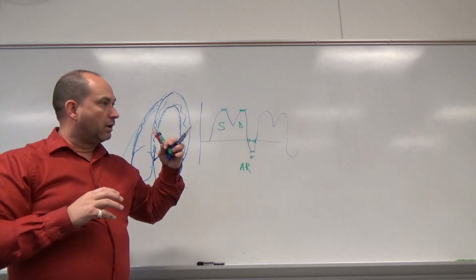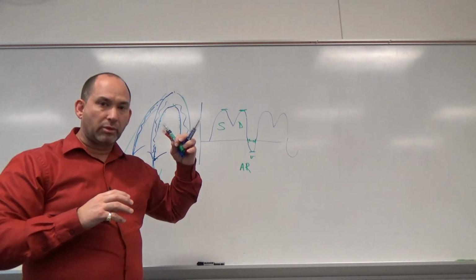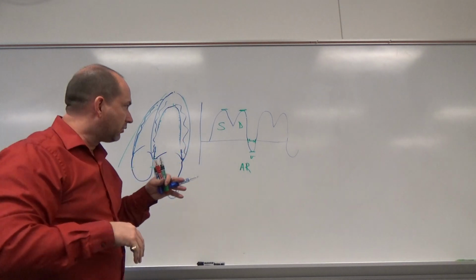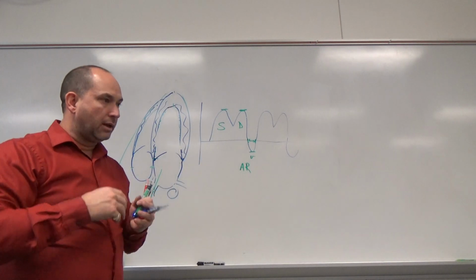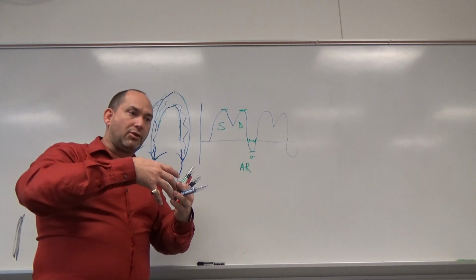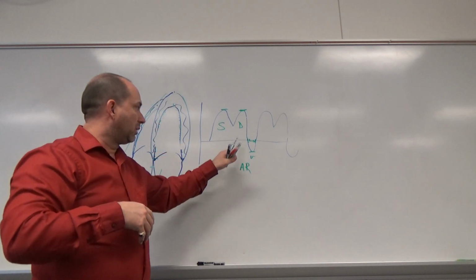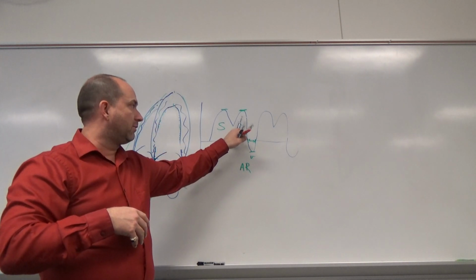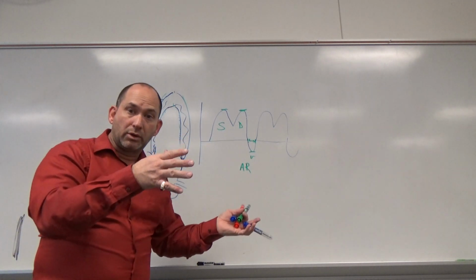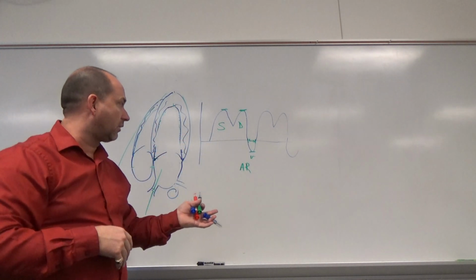Then, when the heart relaxes, for a moment, we get a lack of the push. So that gives us a bit of a pause. And then we get diastole, which then I got that big buildup of fluid inside the atria. It opens up, and a big rush of fluid comes out with the E wave in my mitral valve. This causes forward flow in diastole, and it goes throughout all of diastole.